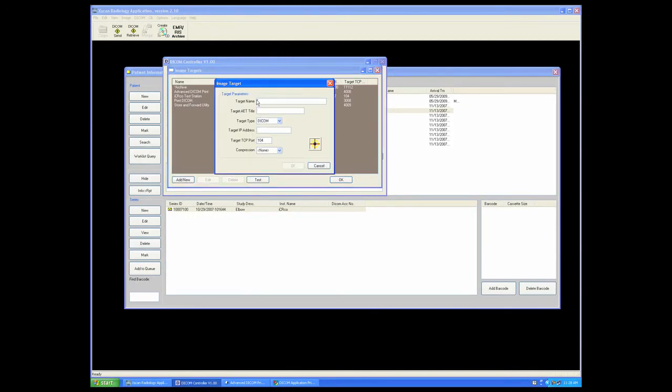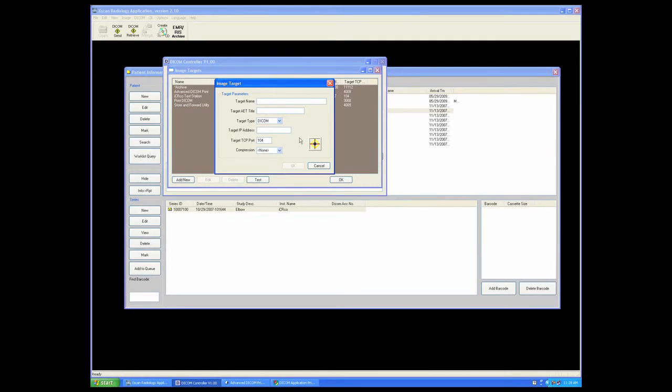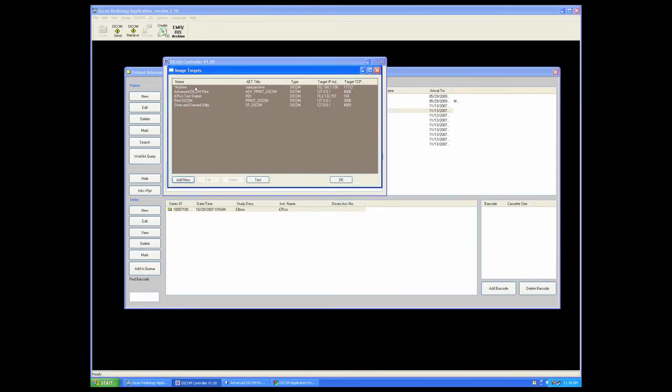Simply fill out the target name, the target AET title, the target IP address, and the TCP communication port. Once that is done, highlight the target and select Test to ping the target.